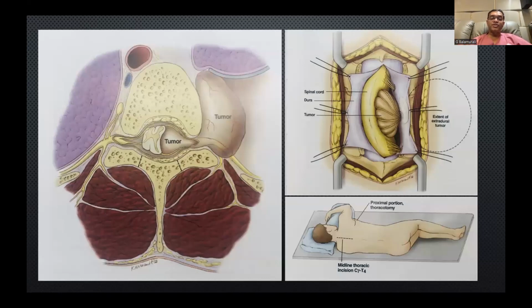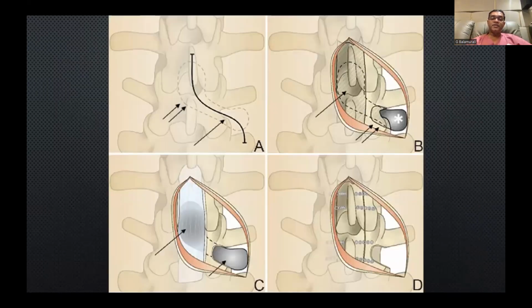If you did an open surgery on this patient, you would do either a midline incision, or a J-shaped incision or a hockey stick incision, and you would have to do quite 2 to 3 levels. A very bulky, big guy, 110 kgs weight. You would have done a big operation. So here we tried to approach this through a very small centrolateral approach, a paramedian approach.